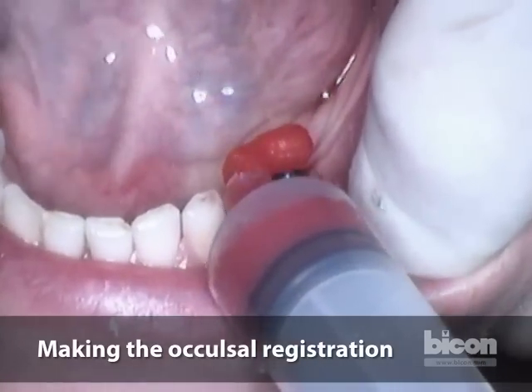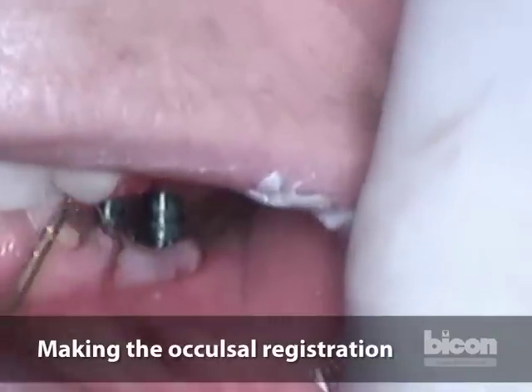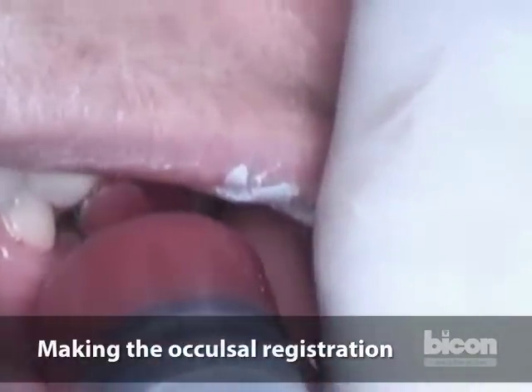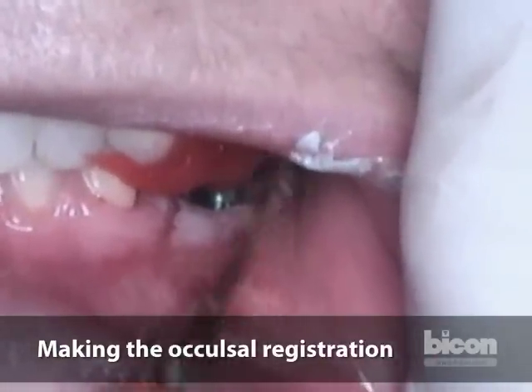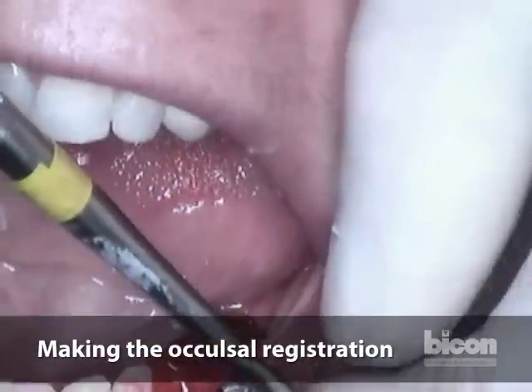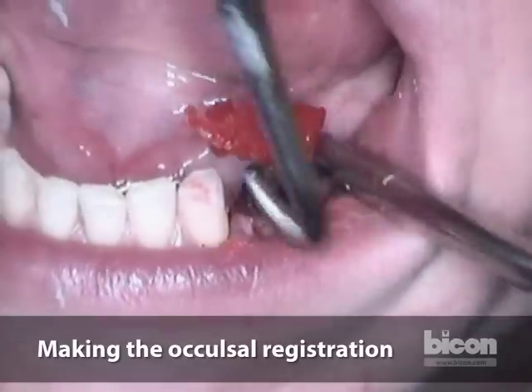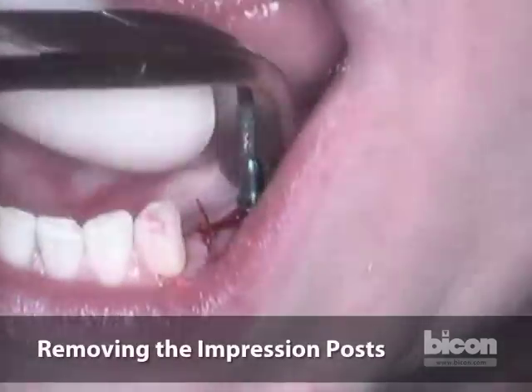We can take the impression right on the impression post. Always remember that the technician does not have a TMJ. We only use full arch impressions — in fact, the BICON Laboratory will not accept quadrant trays or triple trays. We'll replace the temporary healing abutments that Dr. Daher had initially placed.